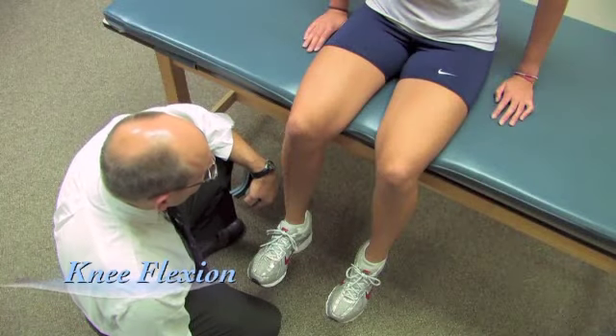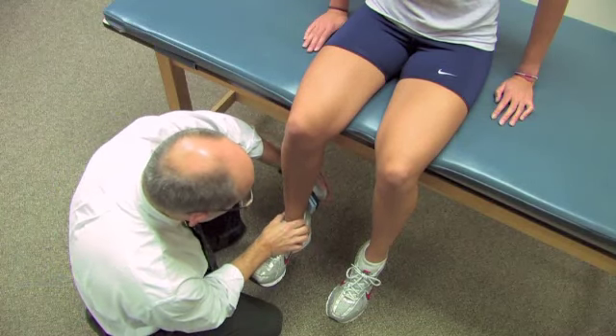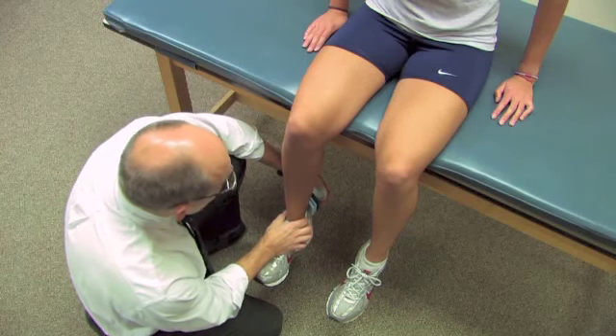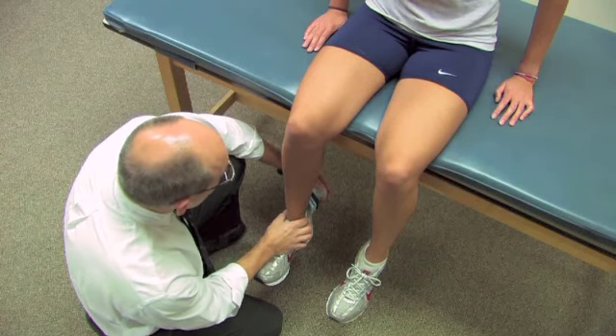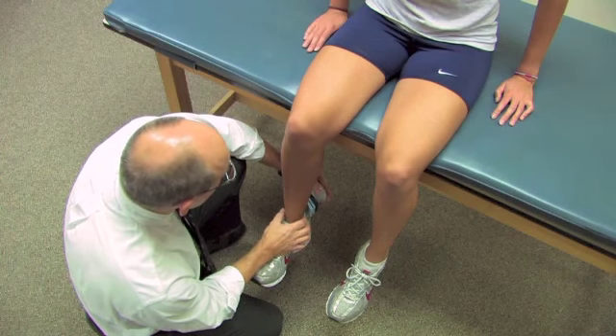Now we're going to measure knee flexion. Again, same position with the body. The dynamometer will again be placed just proximal to the malleoli. But in this case, she's going to bend her knee backwards. And I'm going to ask her to take a second or two, as before, to come to that effort and continue until I say stop.